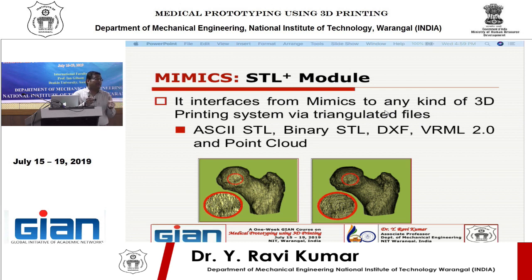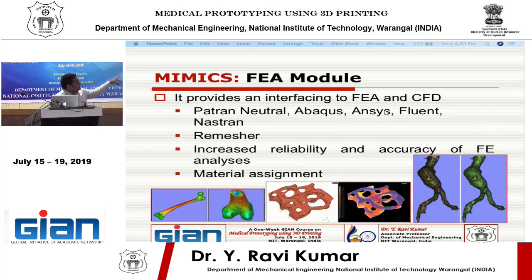But the thing is here, you are creating an interface, these medical images to a particular application. So that's what these modules are available. So you have some FEM module, which you can do some kind of material assignment. So you can do remeshing, or you can use software like ANSYS.